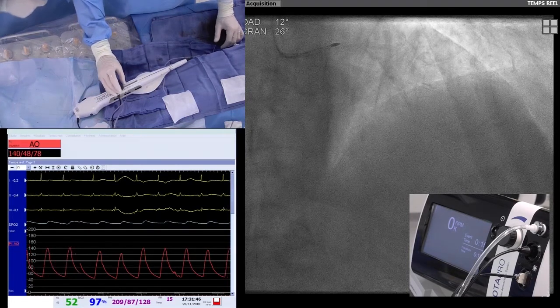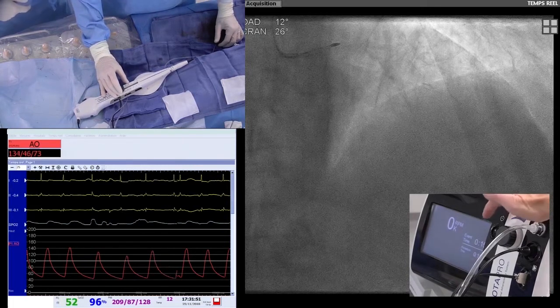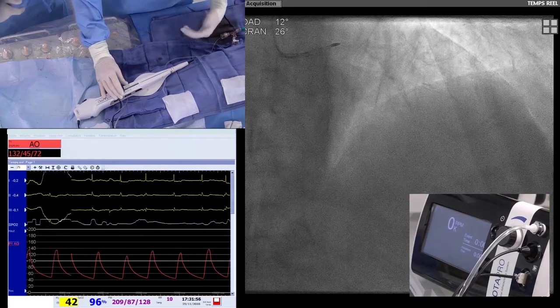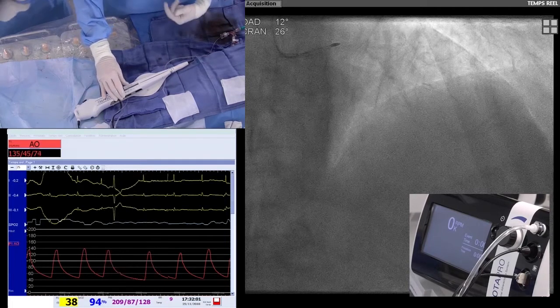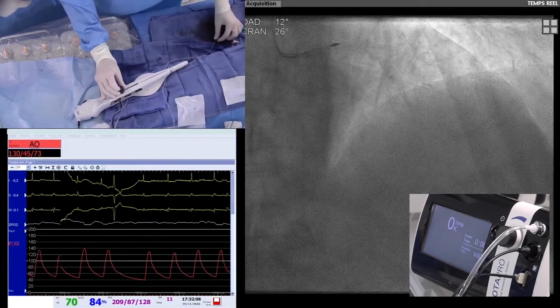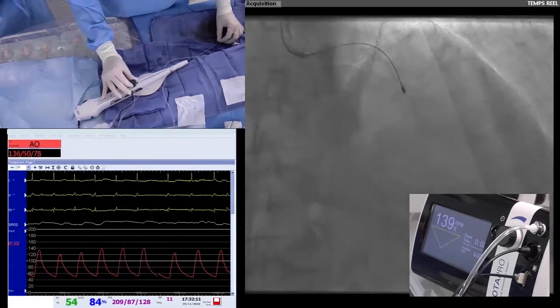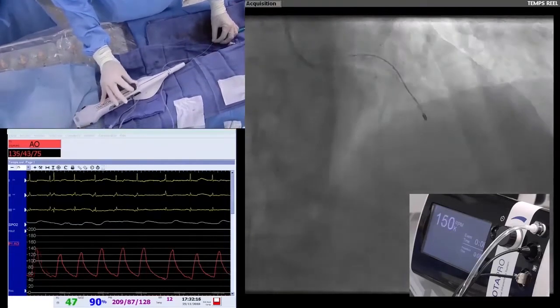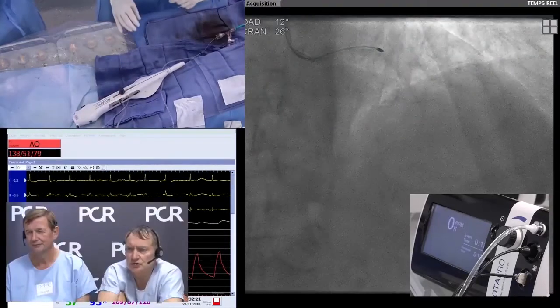You know, the RCA is occluded, so the heart rhythm is quite decreasing, so we have to wait. And due to the long lesion, we have to take time between each run to have enough time for the calcification to go away from the microcirculation. So I will. A question. Yes, just please, a question.